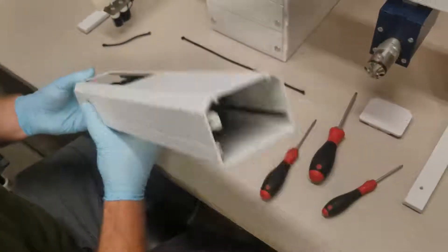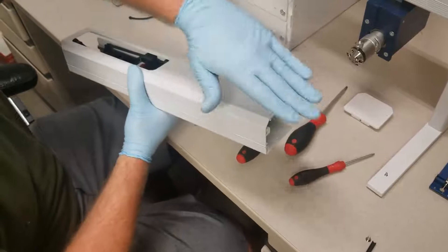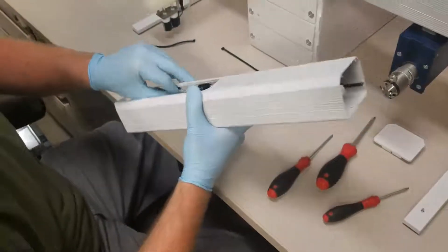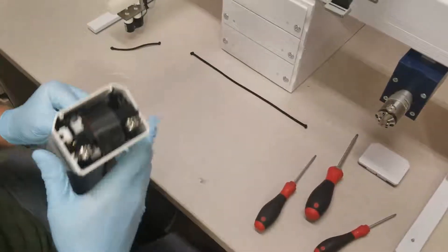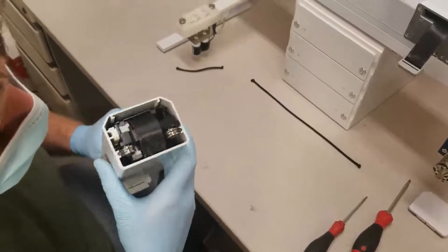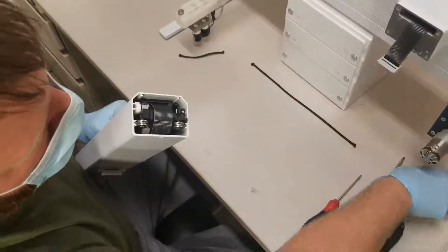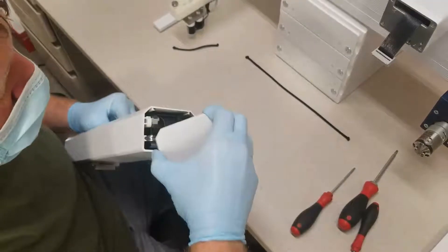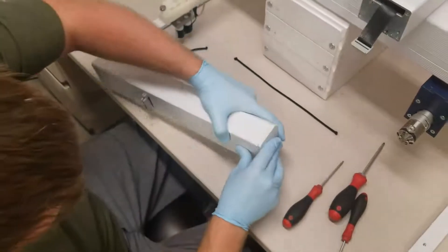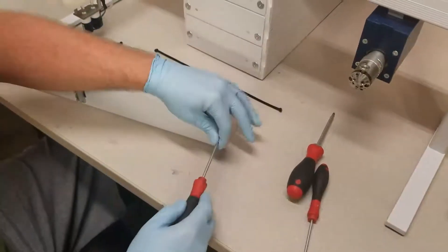Now we'll gently slide the carriage. You want to be careful because right at this point it can slide out and that can cause damage. I recommend grabbing the tension cord and using that to lift it up to where you can access the tension cord attachment. This part can be a little tricky — having two people might be best. We'll now hook the tension cord into the top cap, using a Torx 10 to reattach that screw.